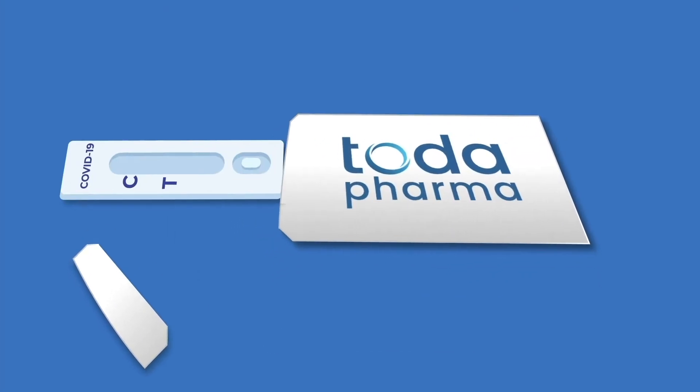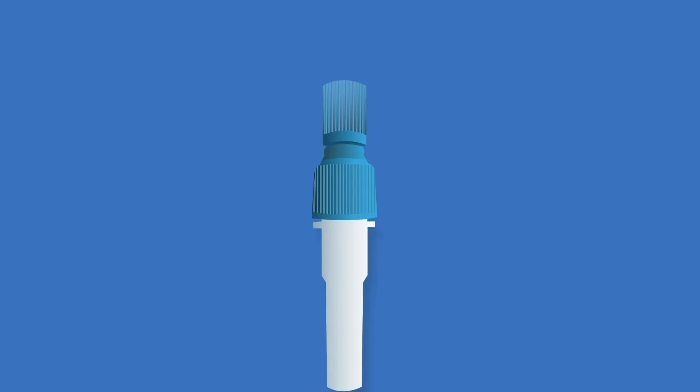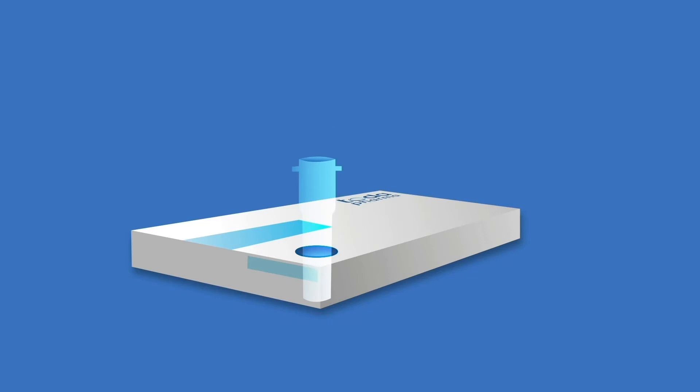Open the sachet containing the test cassette, then unscrew the blue cap from the vial, place the vial in the pre-punched opening on the box, and remove the swab from its packaging.